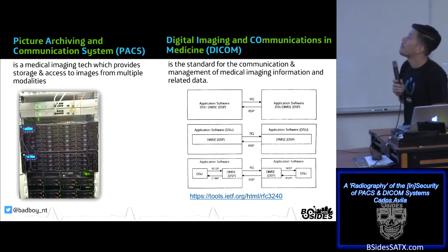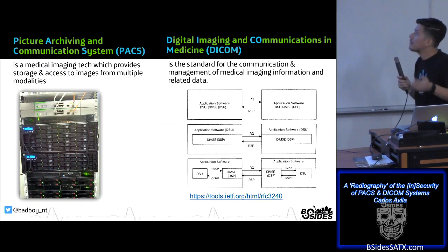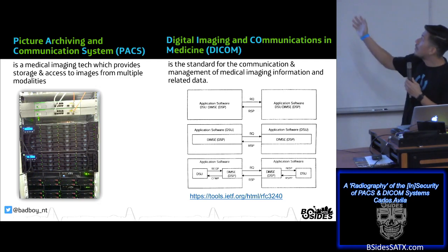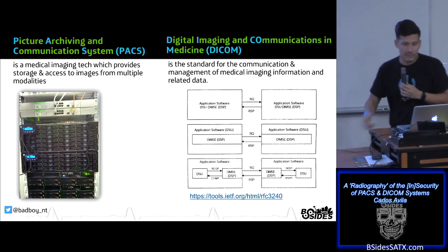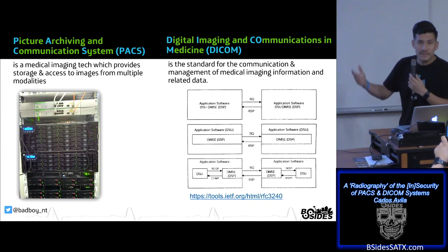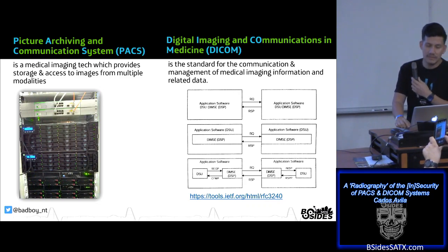So, in real life, the PACS server looks like this. It's a computer, an IT server with high storage and computing power. And DICOM, on the other hand, is a standard or protocol for communication with this type of device, for transmitting images and services, etc. All these services are executed through different commands. For example, storage, query, print, modalities, etc. You can see that in the other slide.